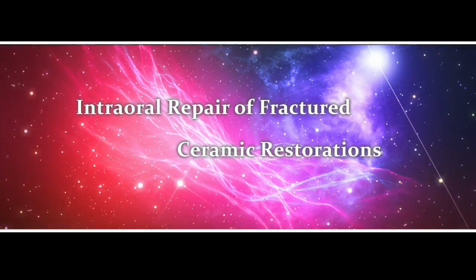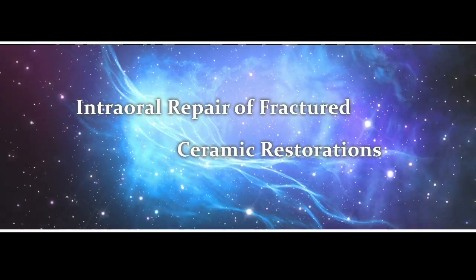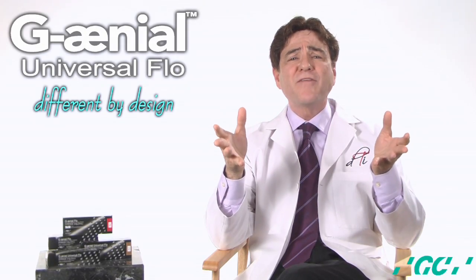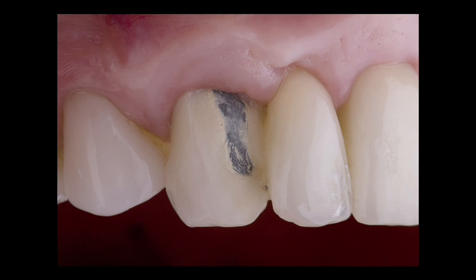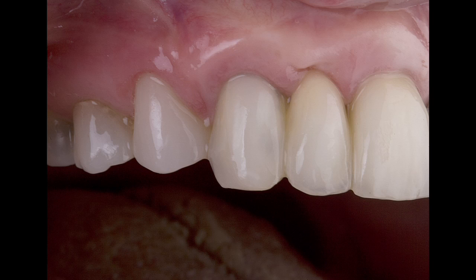These next-generation materials can also be used for transitional intraoral repair of fractured ceramic restorations. Application of flowable composite resins for the intraoral repair of ceramic restorations can increase the longevity and improve the aesthetics of fractured restorations and offer the patient and dentist a cost-effective alternative to replacement.